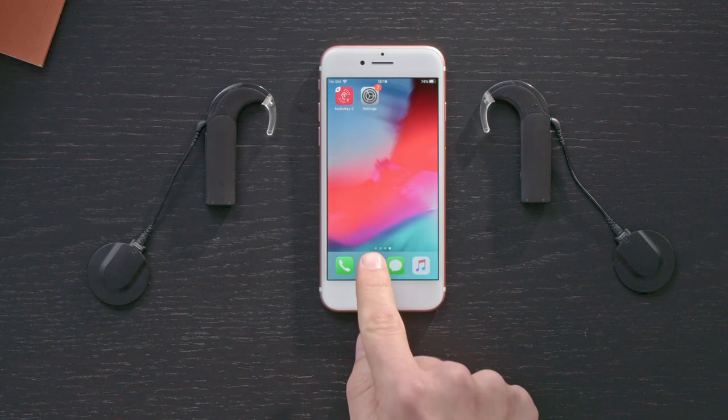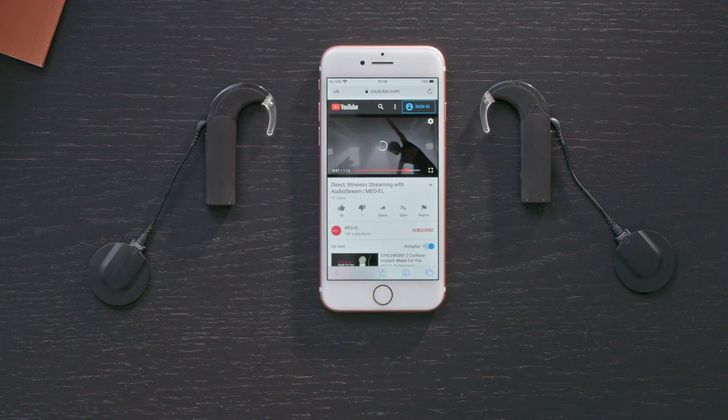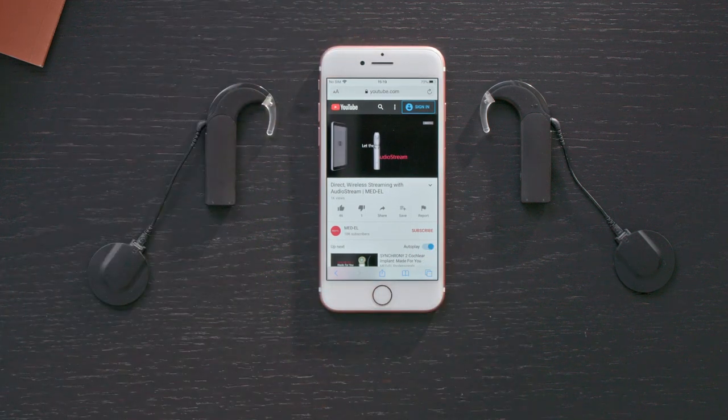Use your preferred application to play audio, including music, videos, and more. Sound from your mobile device will now be streamed directly to AudioStream. To change the level of sound you hear from AudioStream, simply adjust the volume on your device.